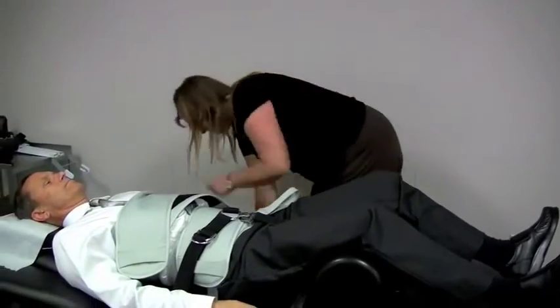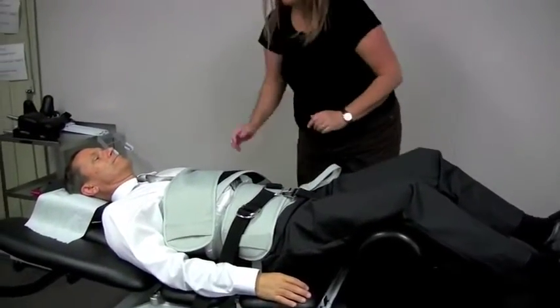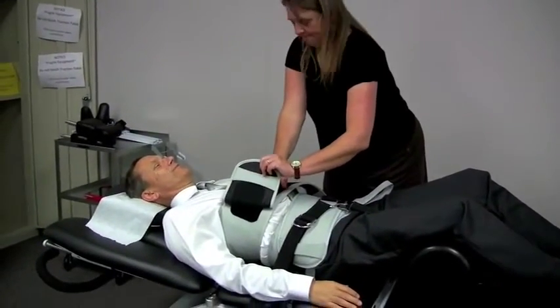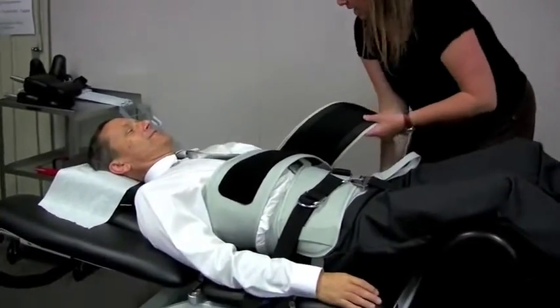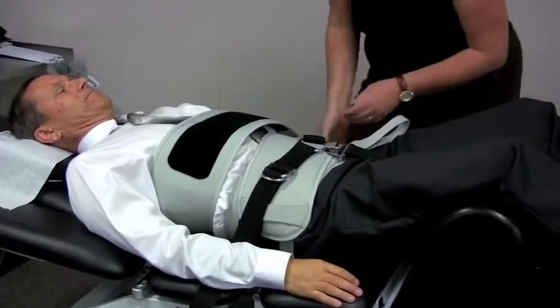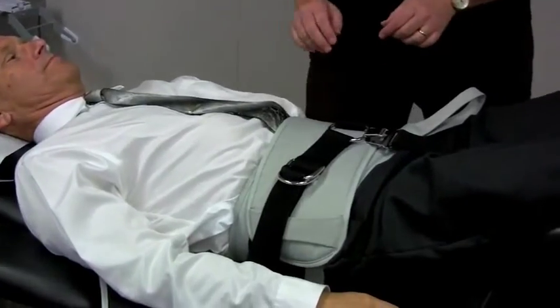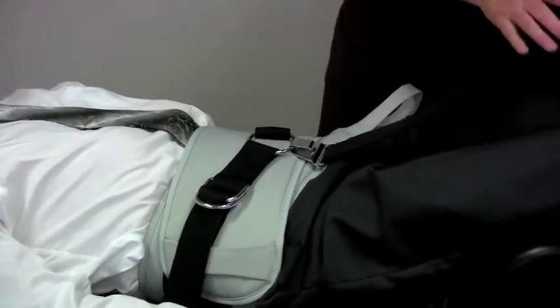Now I'm going to lock the table so you slip slide away. Ready to breathe again? Yeah. It's not too bad, is it? No. And if you don't have that thoracic piece tight enough, there's a chance that he's going to slip too much. Next part, take this part here and unhook it.